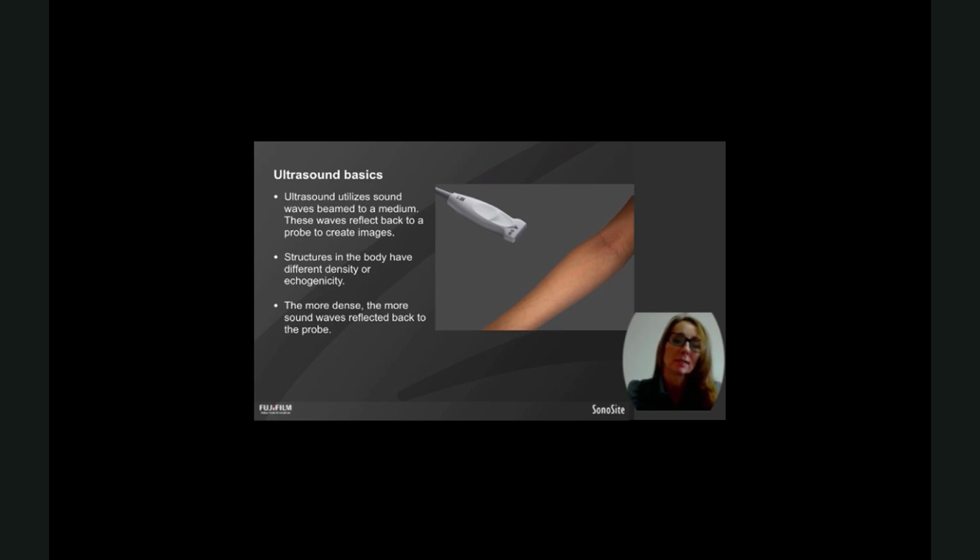Okay, ultrasound basics. So I'm not going to go too in depth. I really feel that for dialysis nurses, we don't need to know a lot about the physics behind the ultrasound machine. I would always recommend in a dialysis setting for straightforward assessment and cannulation that we stick to very straightforward portable ultrasounds with minimal knobs and buttons, because I do find that it really puts the nurses off. I just like a straightforward portable ultrasound with an auto gain, with a single vascular probe, and not too much to really deter or scare the nurses.